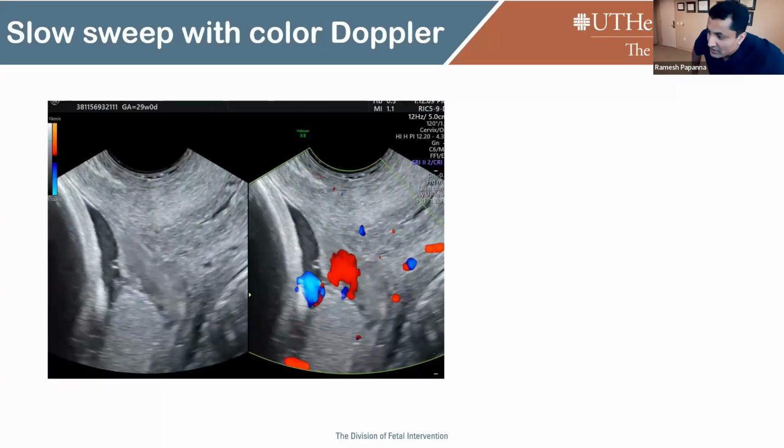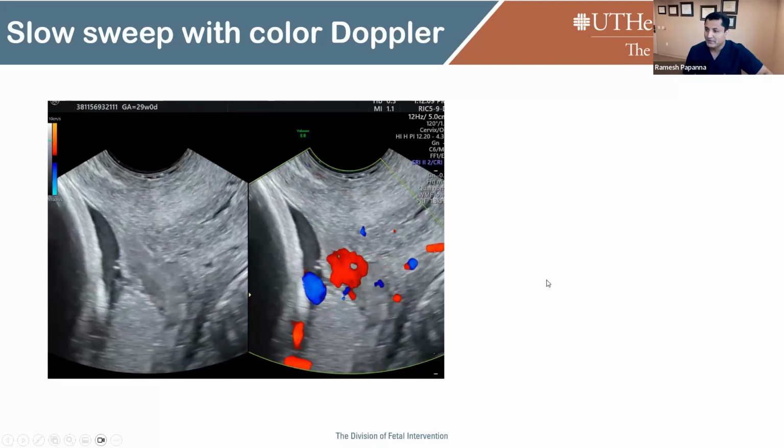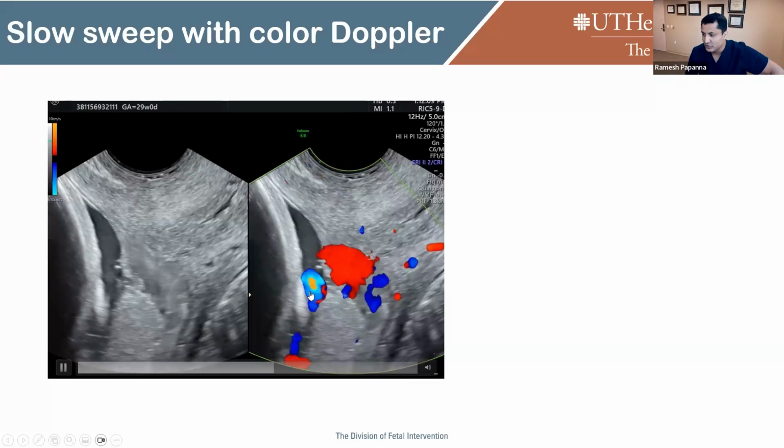Here is another patient, 29 weeks, who also had a couple of scans before that and was not diagnosed at all. I want you all to see if anybody can pick up what I'm seeing. Since it's WebEx, this is where I love interactive talks, but it gets a little challenging to do this virtually. This is the cervical canal, and that's the anterior lip of the cervix. You can see the placenta right there, and I'm sure you can see the pulsing vessel here. That's a fetal artery, maybe a marginal vessel. And right underneath here is the maternal sinus that is flowing into the maternal stroma.